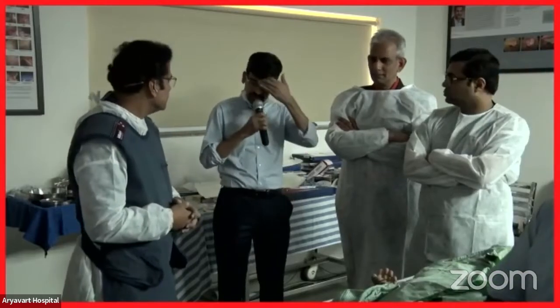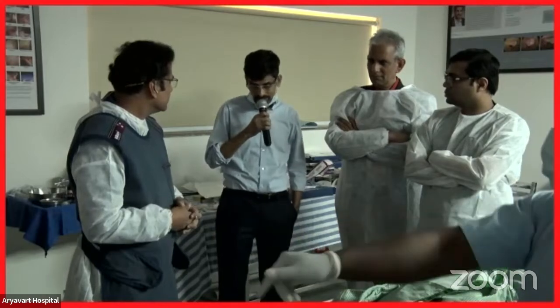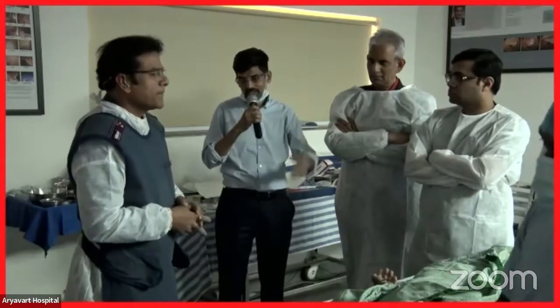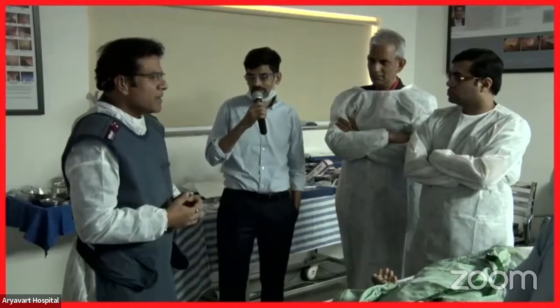Would you say that GJ would make pyloric stents almost invalid, and this to be the standard of care for malignant gastric outlet obstruction?